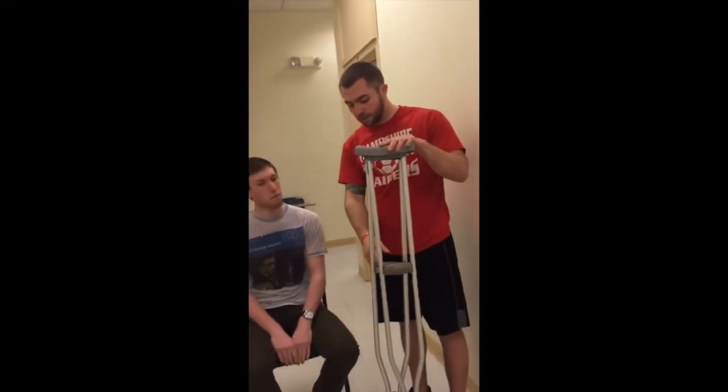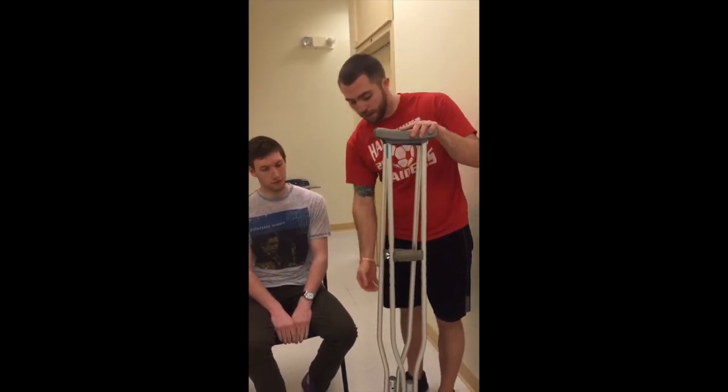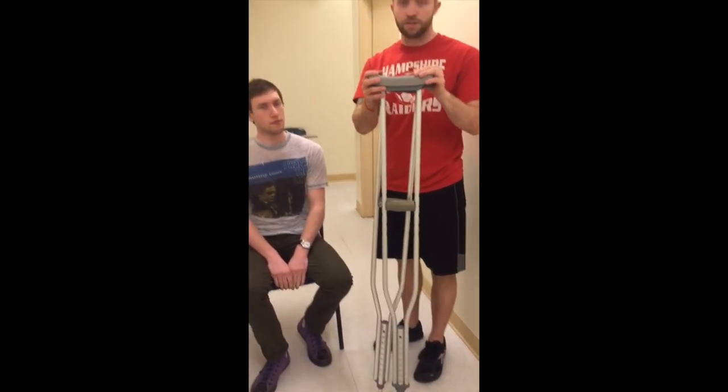And another thing that we wanted to point out is don't change 2 things at once. So don't change the height of the hand grip and then the height of the bottom, the base, at the same time. Okay, it's too many variables, and you want to make sure that you can account for everything.